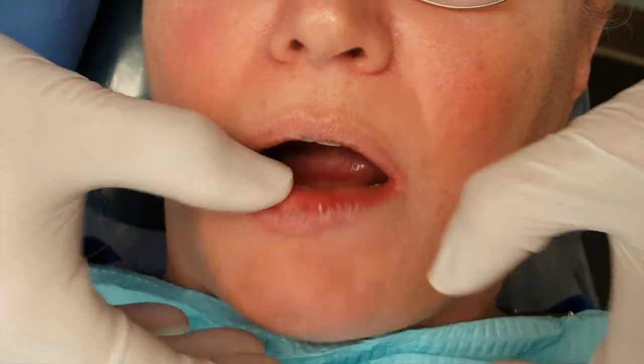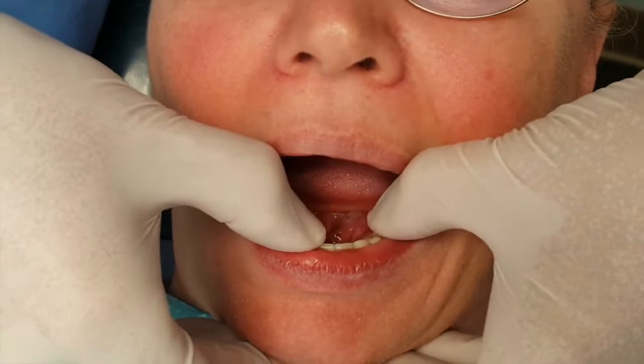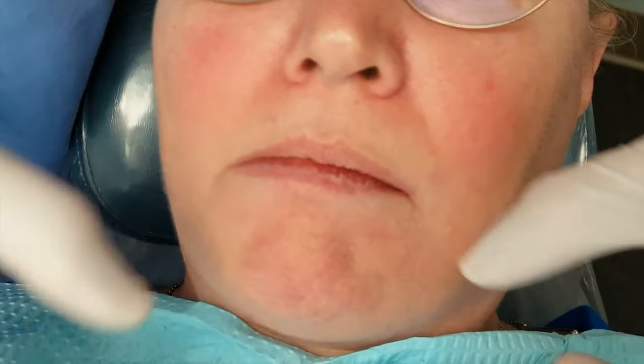How does that feel? Great. It hasn't been loose at all lately, right? Comfortable? Yeah. Has the denture ever popped out by itself? Maybe in the very beginning, but not as of late.